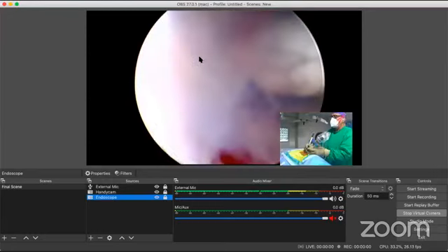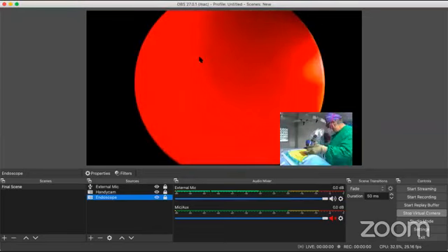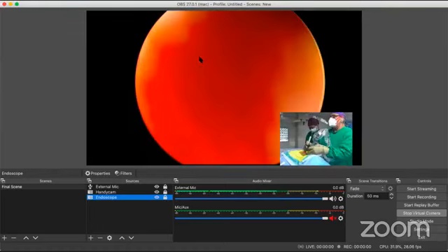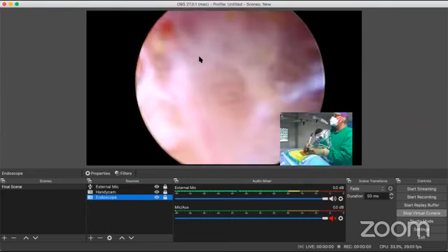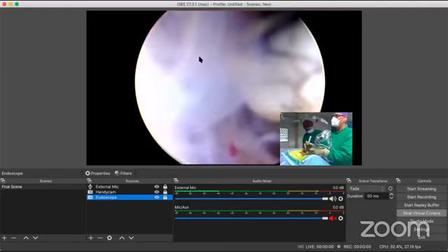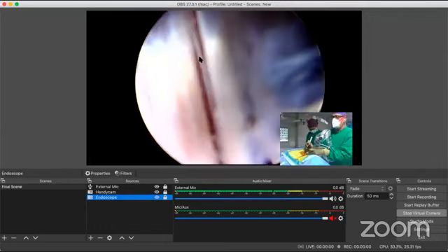Now, I want a C-arm, please. Now the purpose of the C-arm, you'll ask me why. I'm getting a drag. I need some more. Thank you. You can see there's a loose areolar tissue on the bone. You can see my plasma probe. This is by Endovision. Bring the C-arm, please. I need to confirm on which lamina I am.